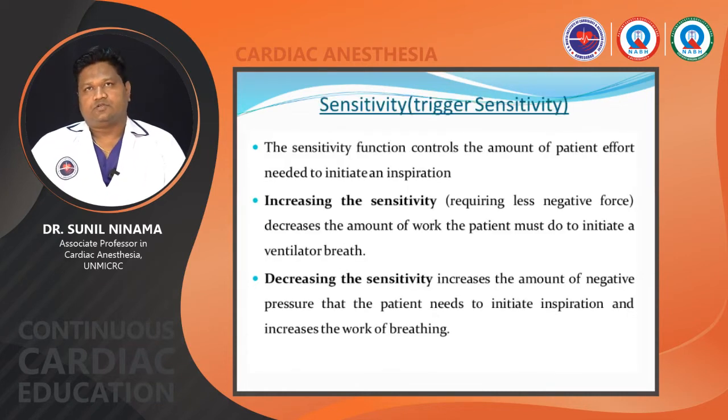Trigger sensitivity. You have to look at the trigger sensitivity when you set the ventilator. The sensitivity function controls the amount of patient effort needed to initiate an inspiration. When you increase the sensitivity, it requires less negative force and decreases the work the patient must do to initiate the ventilator breath. Decreasing the sensitivity increases the amount of negative pressure that the patient needs to initiate inspiration and increases the work of breathing.